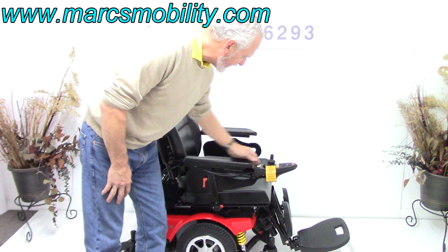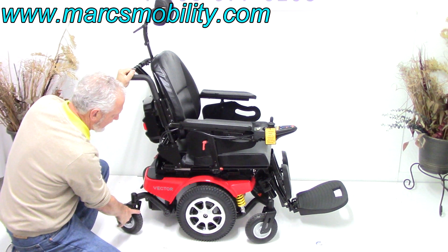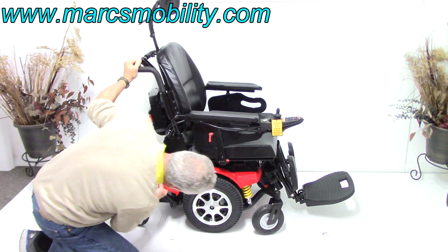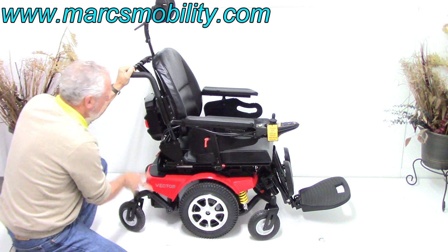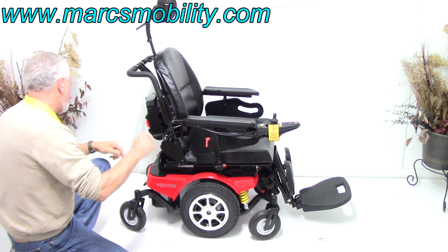Putting it back into driving mode: we've got 14-inch solid wheels, caster wheels in the front, caster wheels in the back. There's heavy-duty suspension in the front that you can adjust by turning this ring, and the same suspension in the back with the spring right here — four heavy-duty suspension points all the way around, giving you a good ride when driving.